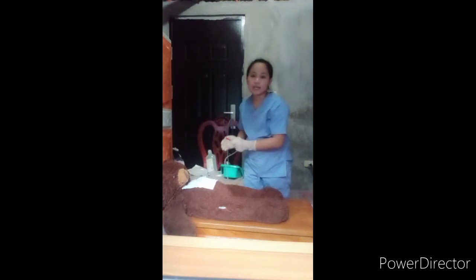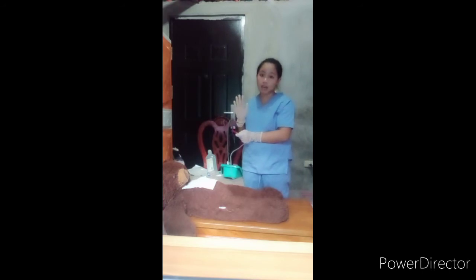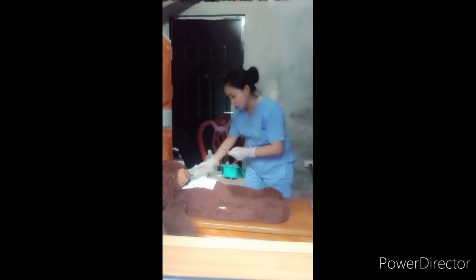So, can you breathe deeply, ma'am? Suction, okay. Then next is, let's reapply the oxygen delivery device. Encourage the patient to breathe deeply if able. So, can you breathe deeply, ma'am?